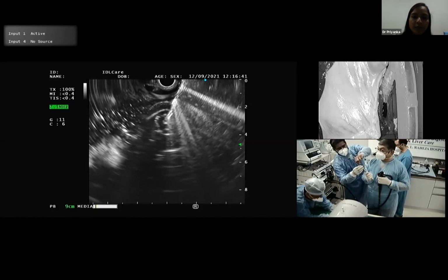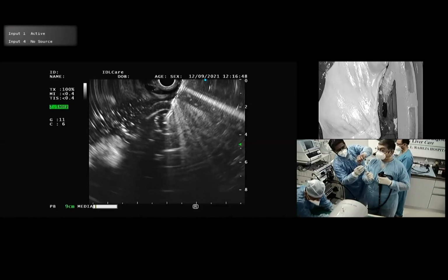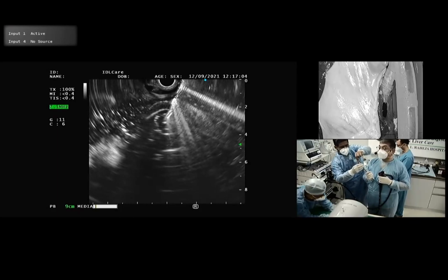There's one question from audience. Yeah. Any tips on reducing shearing of the wire? The only thing you should do is you should not push too much of wire. What happens is suddenly you get excited and you push too much wire. So use millimeter by millimeter. Don't put too much of wire, because if you go in a wrong direction, withdrawing the wire will cause shearing. So that you have to remember.